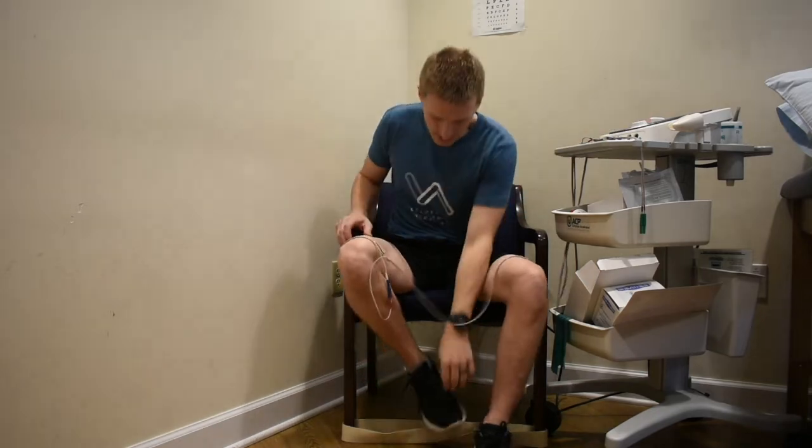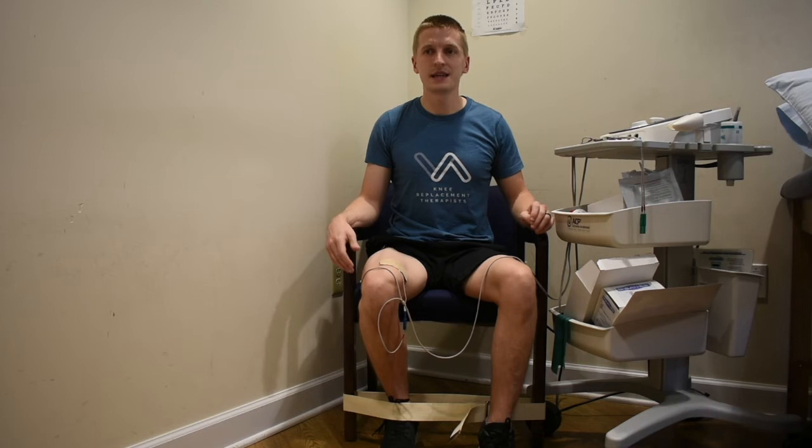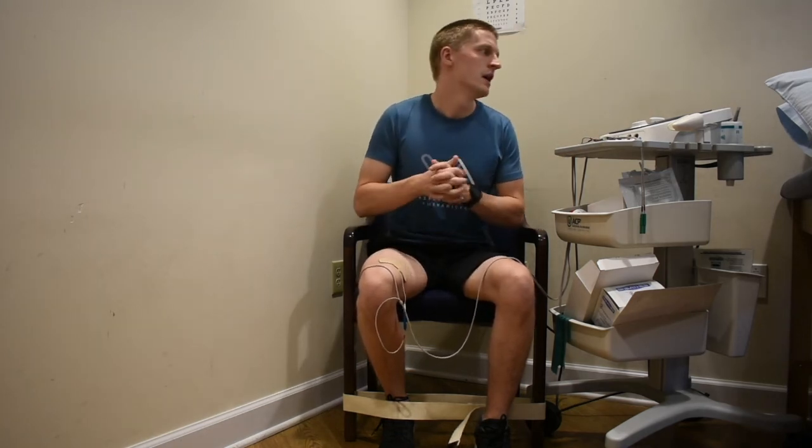Once you're at the strongest intensity you feel comfortable with, go ahead and start the machine. It will start with a 10-second contraction — push into the band and contract those muscles. Note that there is a ramp-up and ramp-down: the stimulation doesn't jump from zero to maximum immediately, but gradually ramps up over two to three seconds to full intensity, then ramps down at the end of the contraction. During the rest period of about 50 seconds, prepare to actively contract those quadricep muscles again when the next cycle begins.